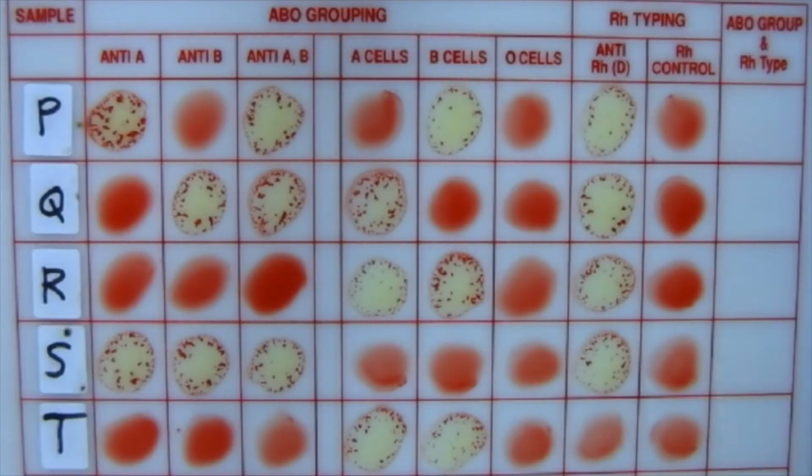And now I'm going to bring you to have a closer look at the tile. So we have helped you to run 5 patients for the blood group determination.